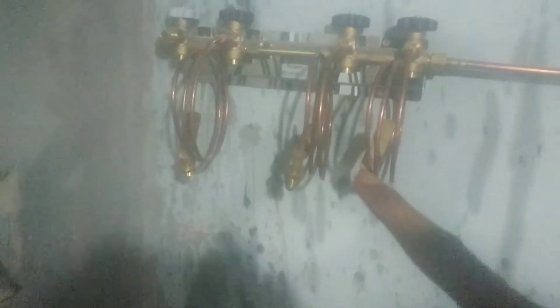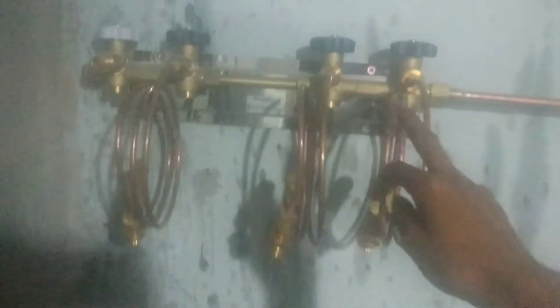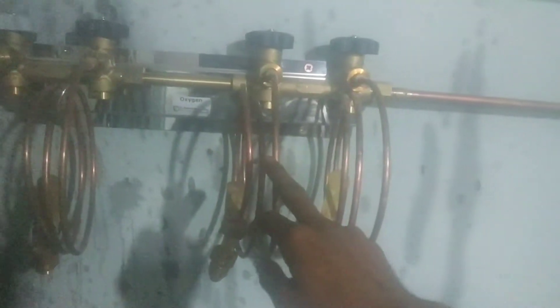It goes through from there, then it runs through to the building. We have the second manifold over here as well. These are the connectors as well, to connect the oxygen cylinders.